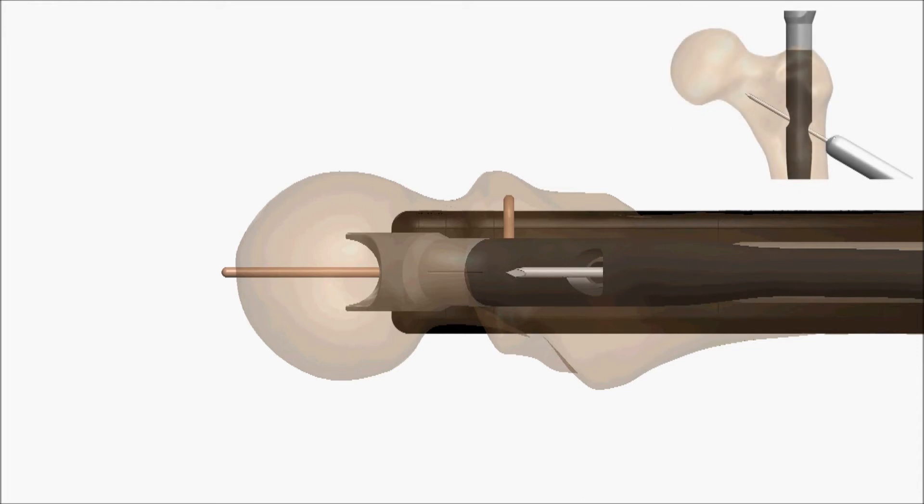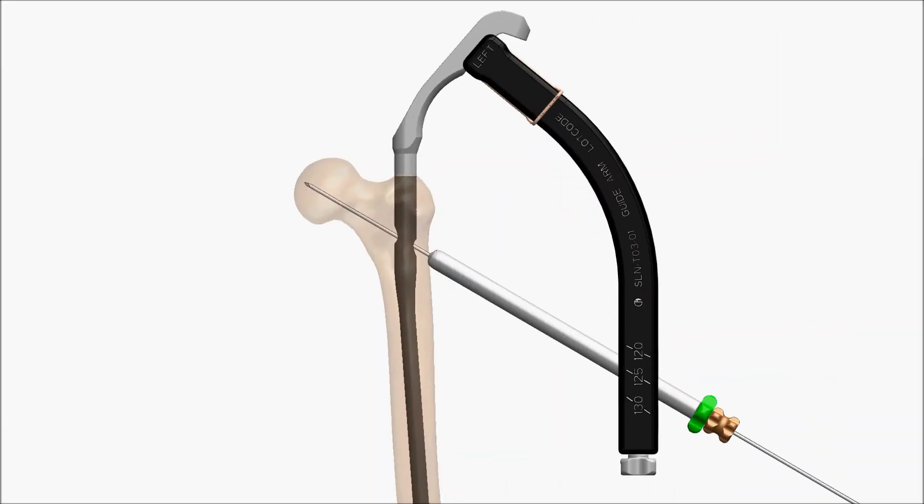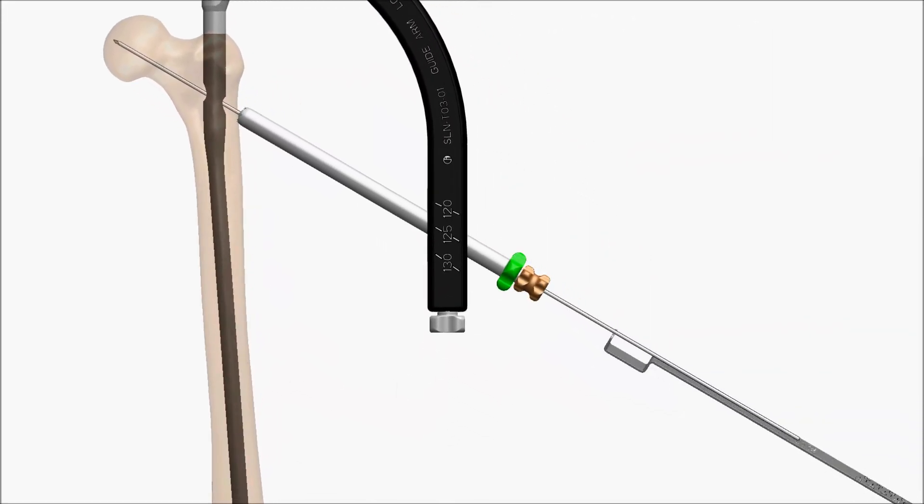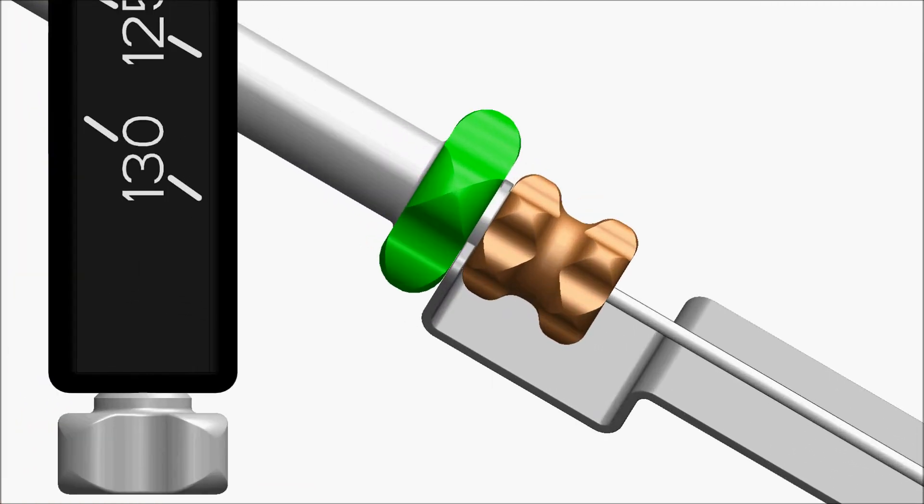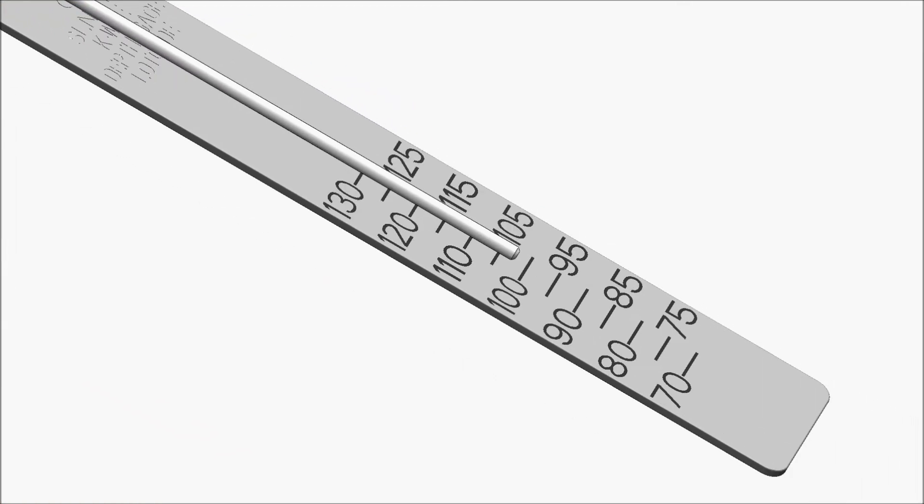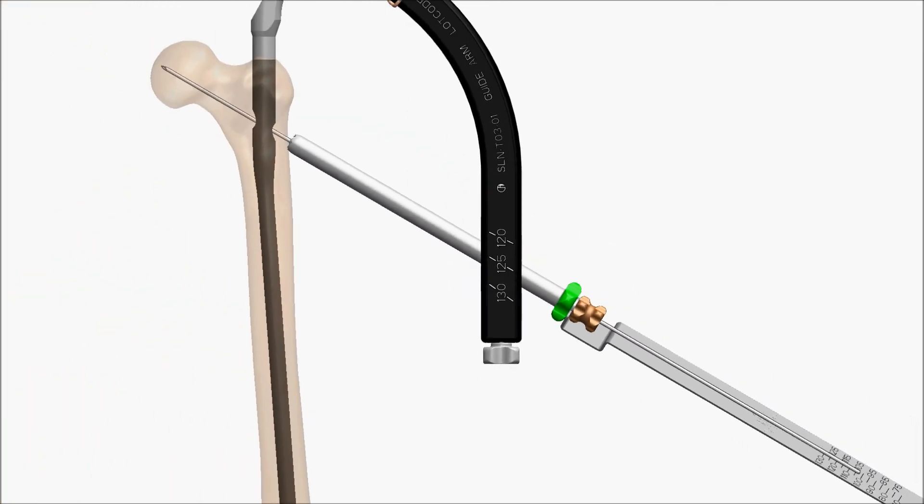Insert the guide pin to the level of the subchondral bone. Determine the drilling depth using the guide pin ruler. The value obtained is a direct measurement to the tip of the guide pin.